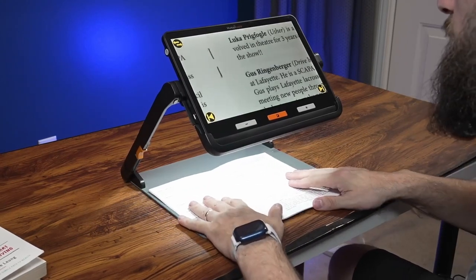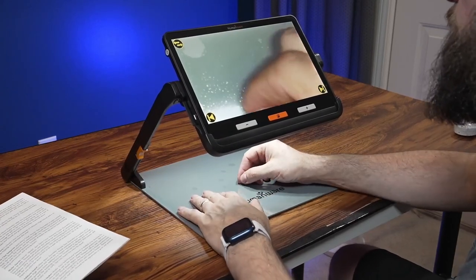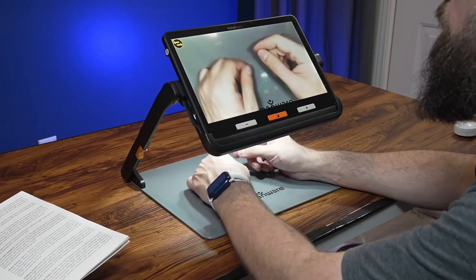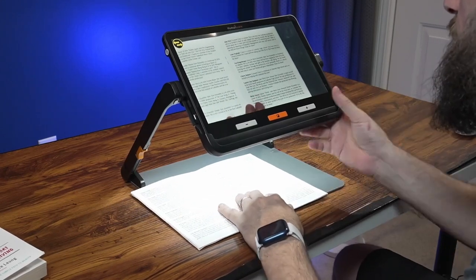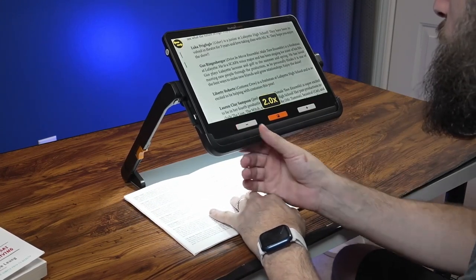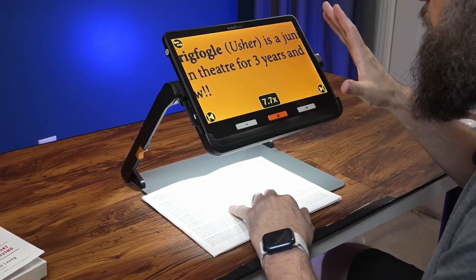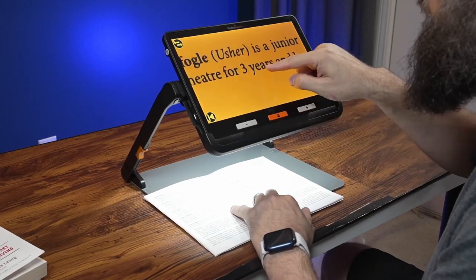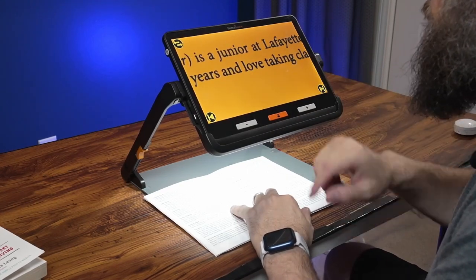You have plenty of room to move around your reading material, fill out forms, or even use it for crocheting and knitting. Everything still works exactly the same — zoom in, zoom out, change colors. And like I mentioned before, when docked in the stand, even in live view, you can pan back and forth, left and right using the touchscreen.